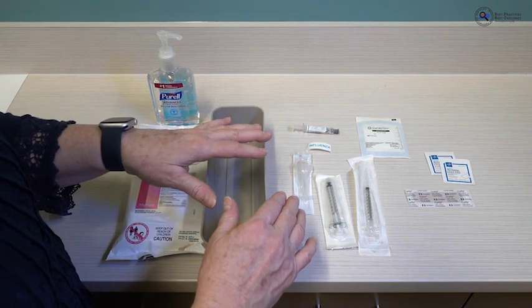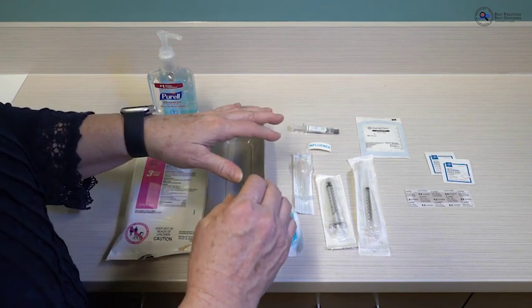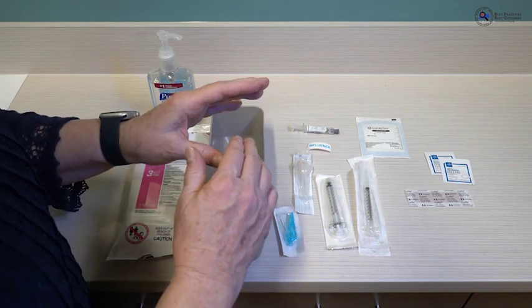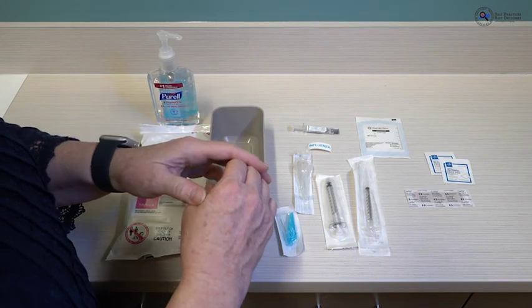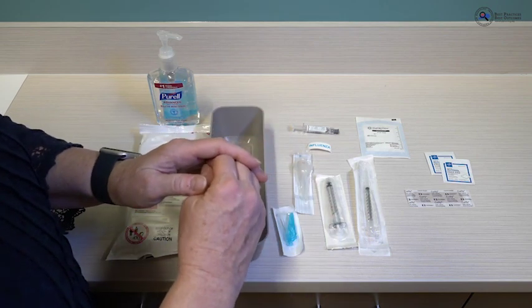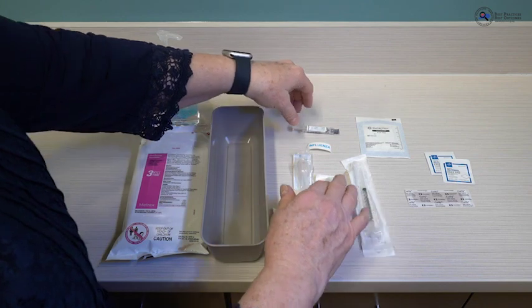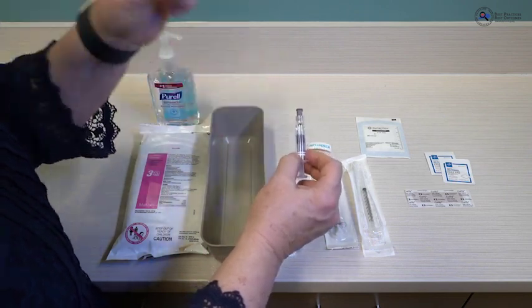Evaluate your patient and know their muscle mass so you can select the appropriate needle length to deliver the vaccine into the muscle and not into subcutaneous tissue. For most children, use a 5/8-inch needle. Once a child becomes adolescent with more body mass, you may need a longer needle — perhaps an inch, or up to an inch and a half for very large children. Influenza vaccine comes in multi-dose vials or pre-filled syringes; we'll go through the elements of handling a pre-filled syringe.